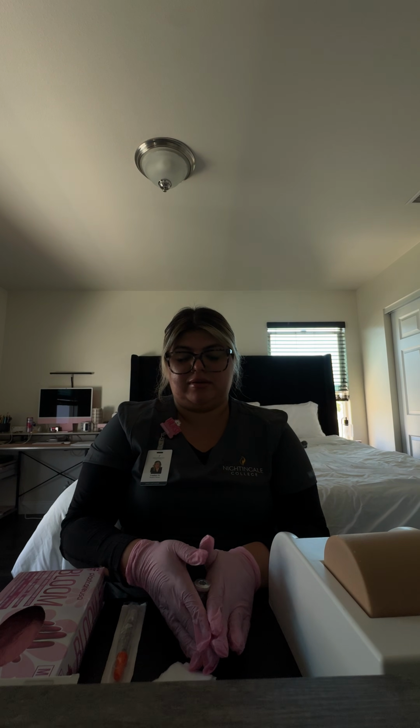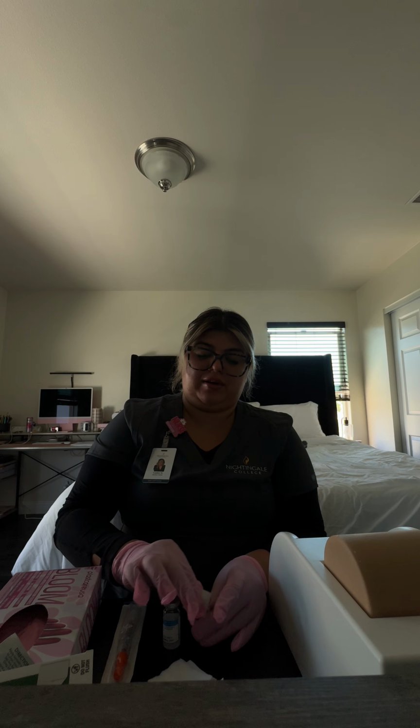I'm going to go ahead and grab both medications and roll them from side to side just to warm them up and make sure everything is mixed appropriately. Okay, I'm going to set these down. I'm going to grab an alcohol pad. I'm going to open that. And we're going to clean the top of both vials.